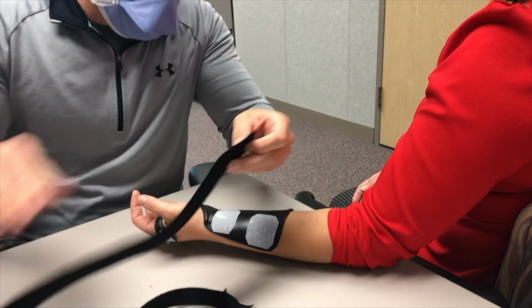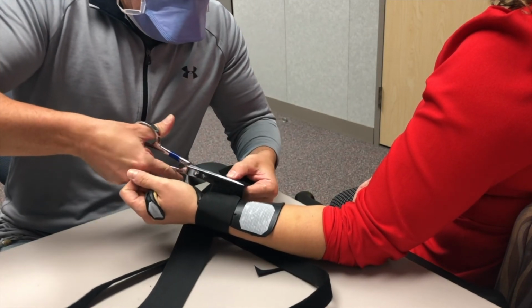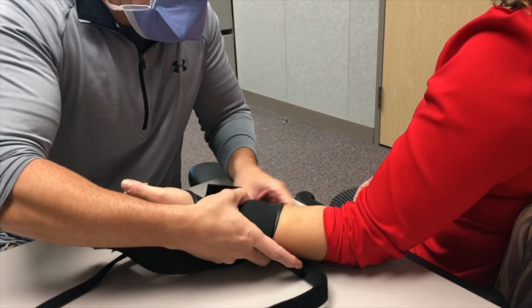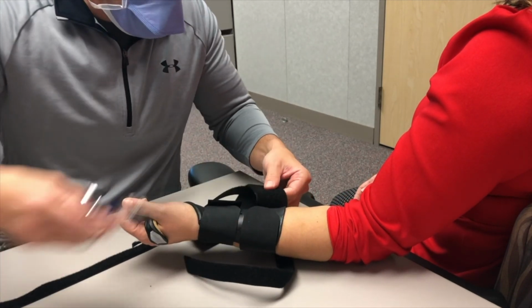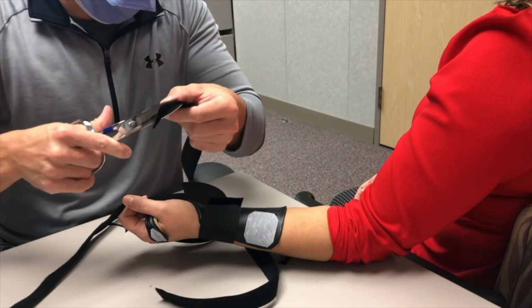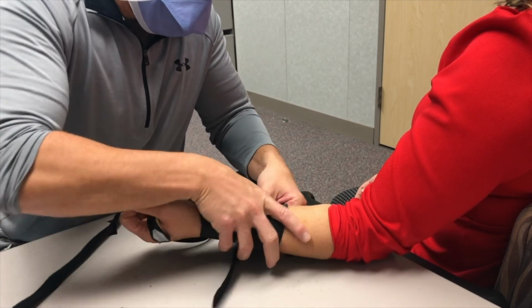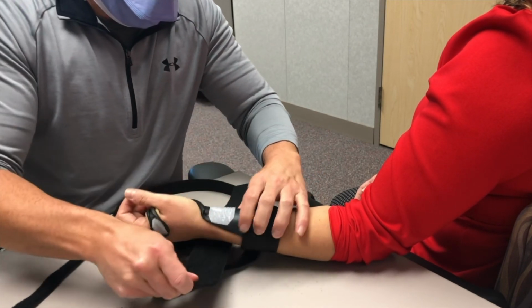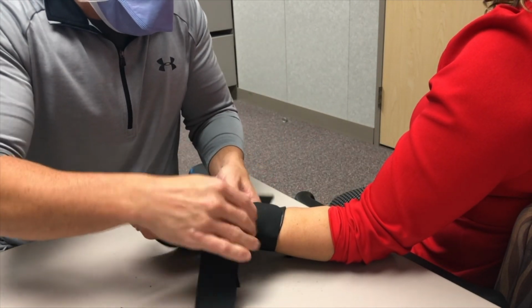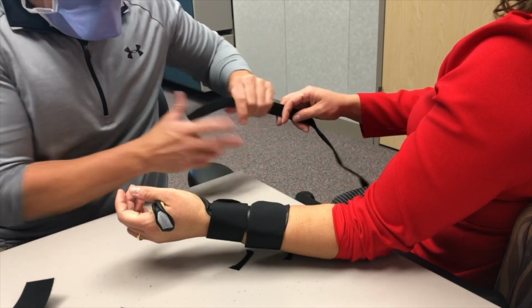You always want to round your edges to increase cosmesis. And we always need to strap over the joint we are immobilizing in order to neutralize our reciprocal parallel forces. We want to round our splint edges, and that's what I'm doing now. You think that may not matter, but your clients will always ask you to do so, and they will complain about it on subsequent visits.